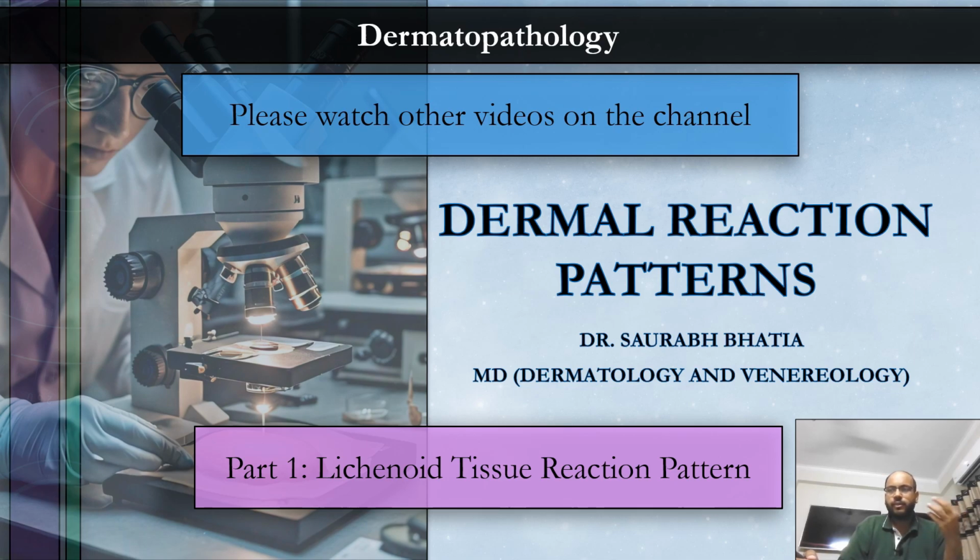For the residents who are doing graduation in dermatology, we will discuss the lichenoid tissue reaction pattern, the common features, and then we will discuss individual disorders so that we can focus more on the differentiating pathological features or the common pathological features of different disorders under a slide. Okay, so with that, without much further ado, let's start our discussion this week on lichenoid tissue reaction pattern.